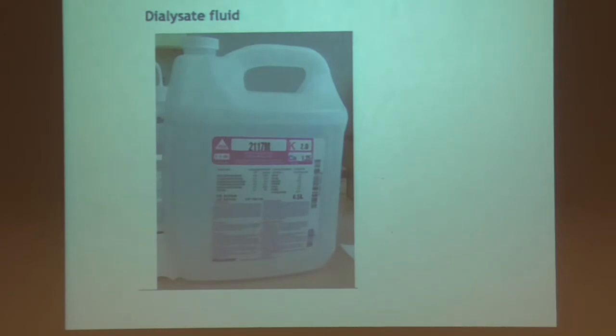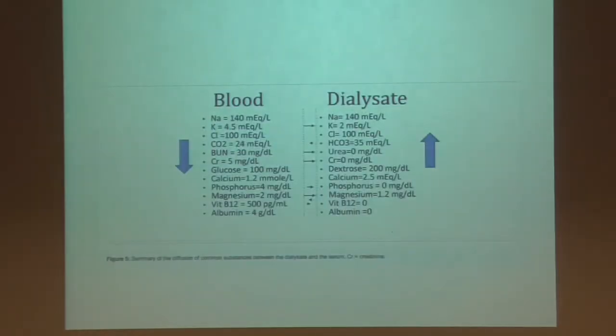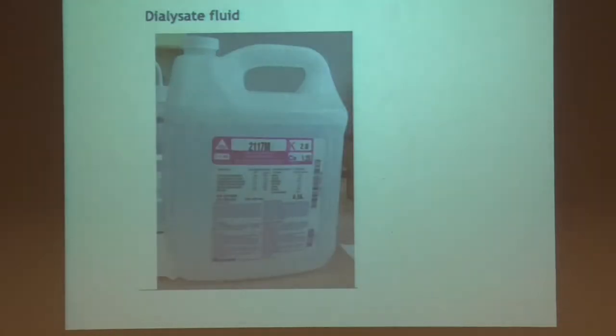The way we do that in a regular dialysis, this would be the movement. You're running a lower potassium in your bath, a higher potassium in your blood. That's how we balance that out.